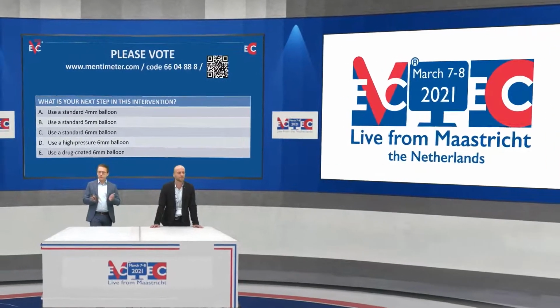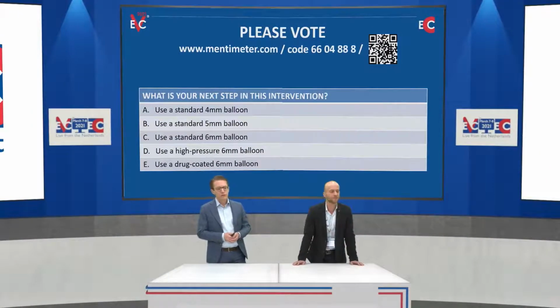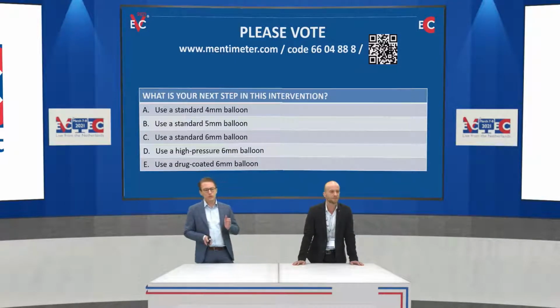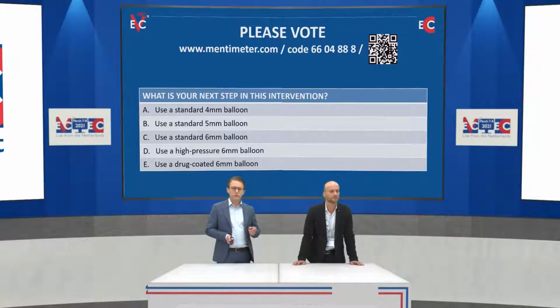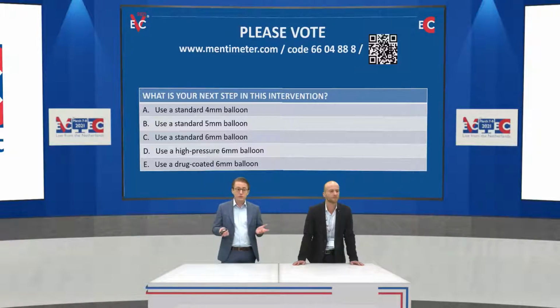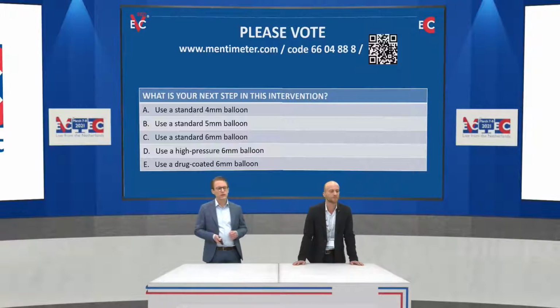What do you think we should do in this case? And it's time to vote again. It's also voting for different sizes of balloons. Would you go for a 4 millimeter, a 5, or a 6? And when you think about the previous case, would you start with a high pressure balloon, or would you maybe go for a drug-coated balloon?